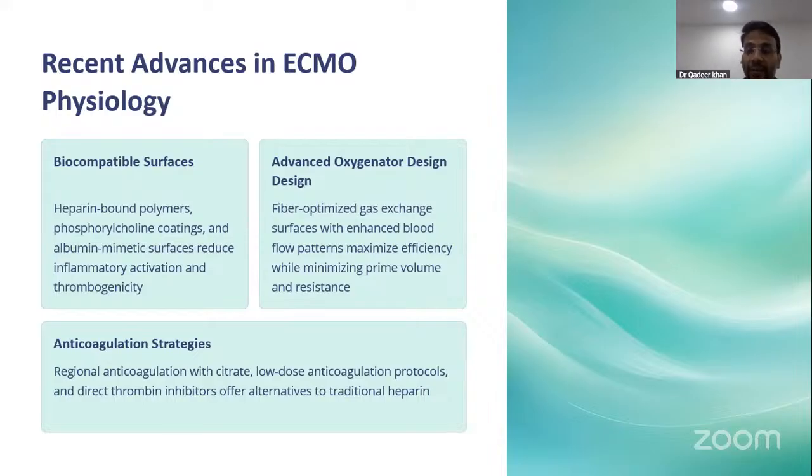Anticoagulation, as I told, there are heparin-coated circuits now where we can use low dose heparin for initial periods. Later on, when the patient goes for a longer ECMO, after a period of 1 week or 10 days, at that point of time the efficacy of these heparin-coated circuits may come down. So longer acting materials, where we can use heparin-free circuits, are also being tried.